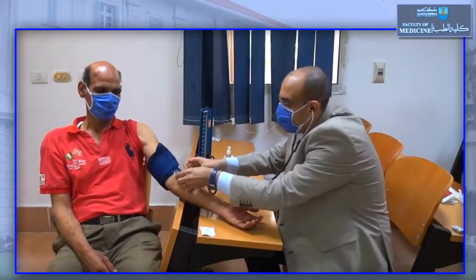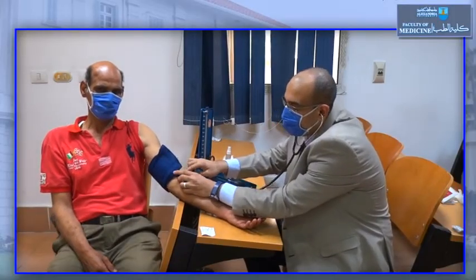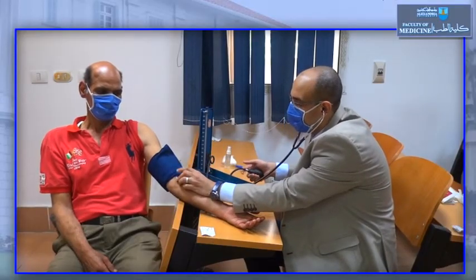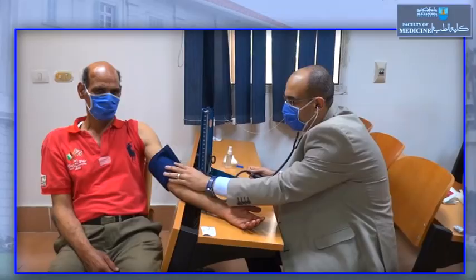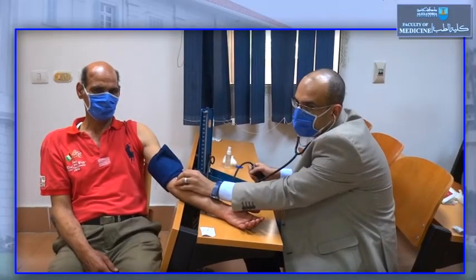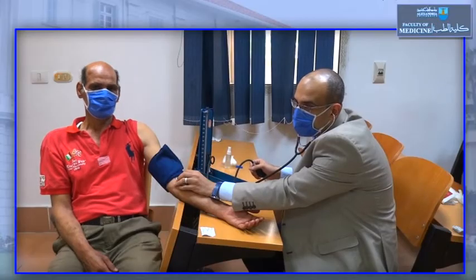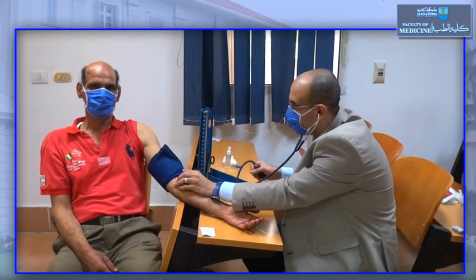and then we do the auscultatory method. We put the diaphragm of the stethoscope at the lower edge of the inflatable cuff, and we elevate the mercury by 20 to 30 millimeters of mercury above what we got in the palpatory method, which is 120.